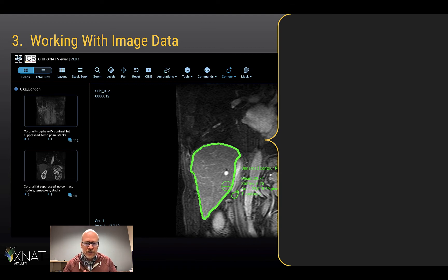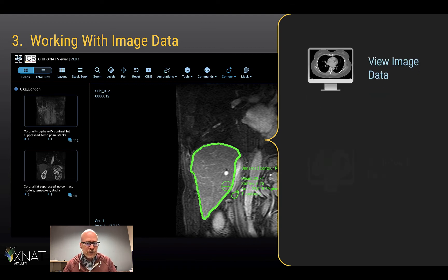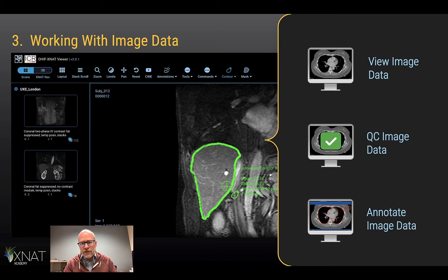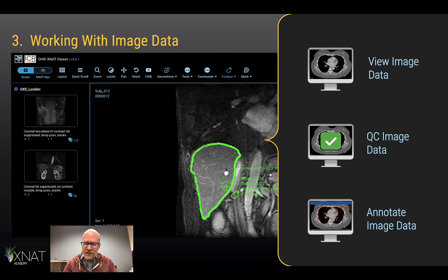Once you've got your image data in your XNAT, you can do all kinds of things with it. You can view the data, QC it and set quality, and you can annotate that data and save those annotations with a powerful new XNAT OHIF viewer.